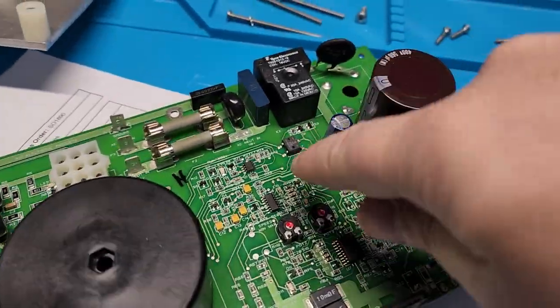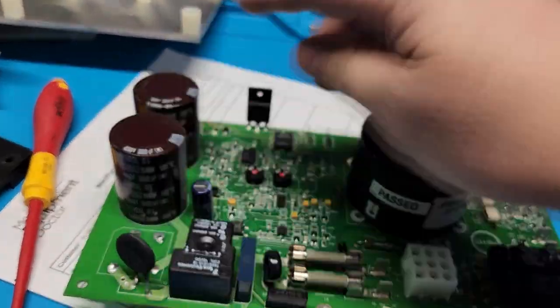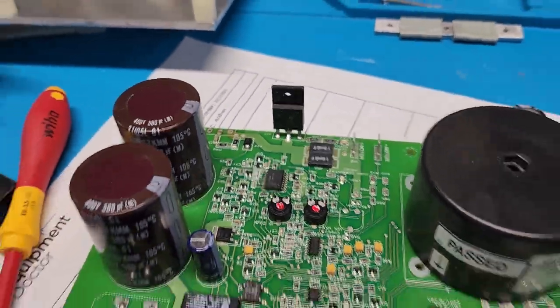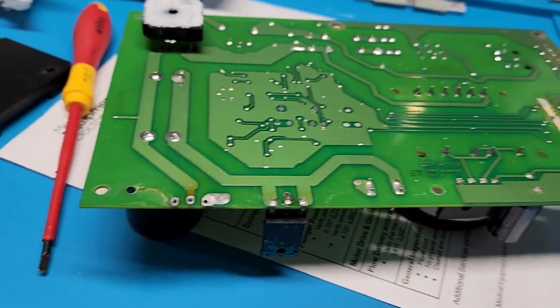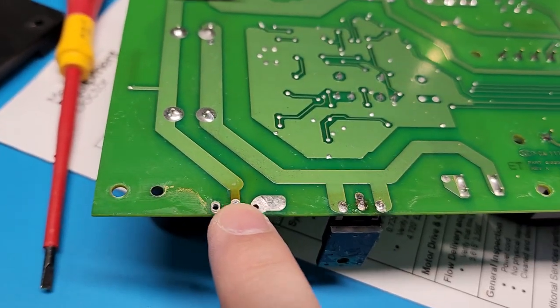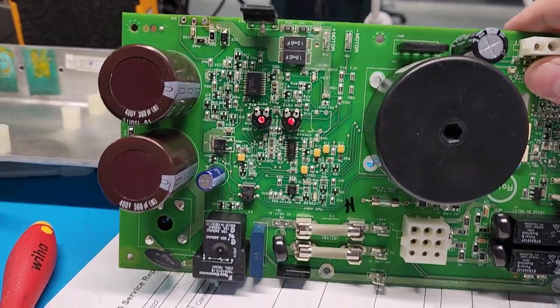So anyway, there's definitely at least three different power phases on here, and obviously the big one is going to be the one that's powering your motor and your MOSFETs right here. And you notice I have one of my MOSFETs off the board. That would be the one that was most suspect. You can see a slight bit of heating on the trace, and we have some residue, which usually indicates some sort of fluid, but I think this is just maybe some extra flux.